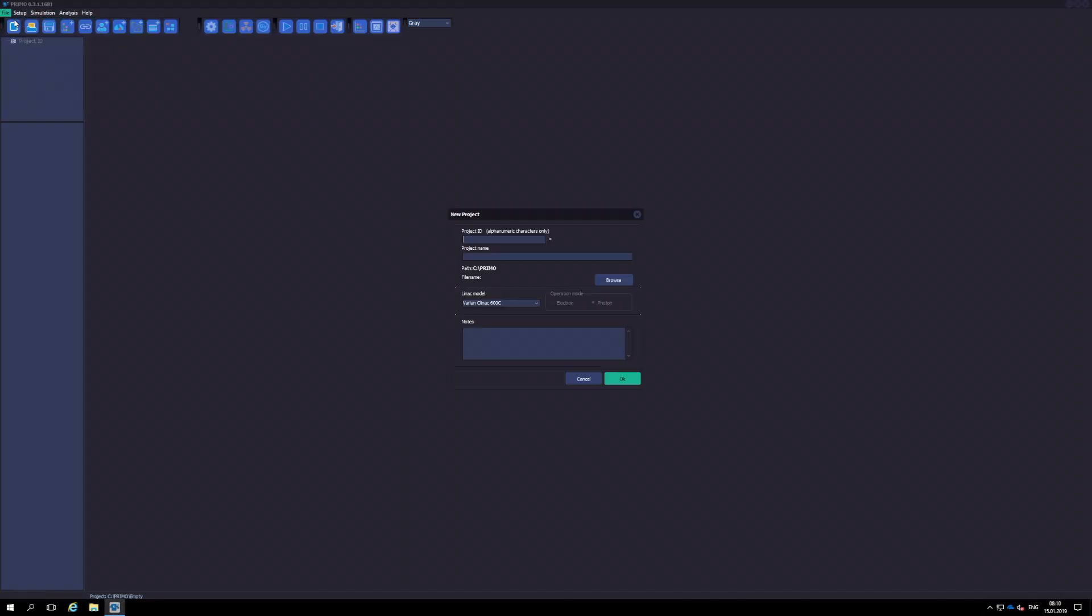First, we open a new project. The type of linac chosen must coincide with the one used for tallying the phase space file. Also, the type of beam and nominal energy must coincide with those used for the phase space file computation.